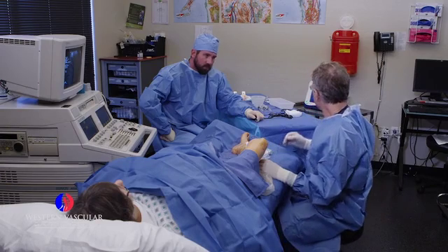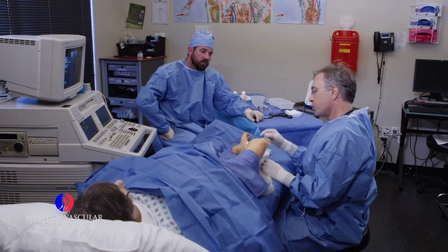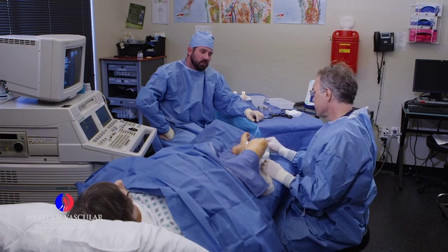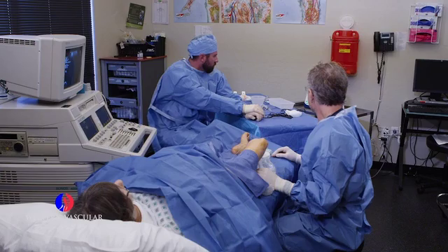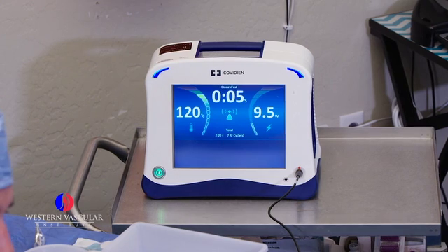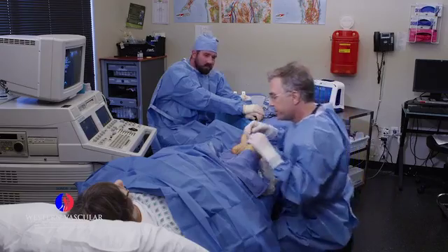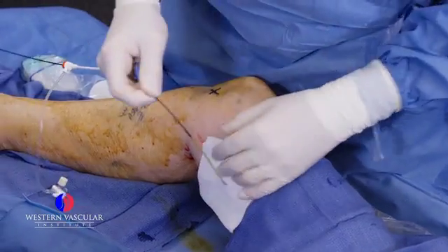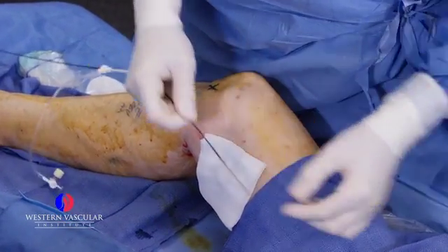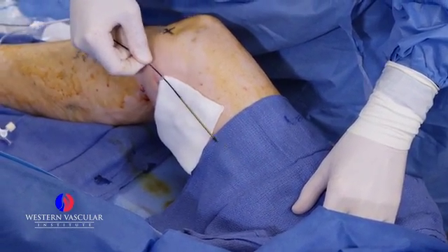We're burning the vein segments in 20-second intervals, advancing the catheter back towards the entry site between the hashes, pulling it back about five centimeters at a time. This is our last segment where we're ablating the dilated saphenous vein. We'll go ahead and take the catheter out. There you see the heating element — that was the heat source — pulling it back station by station at 20-second intervals until we completely close that saphenous vein.